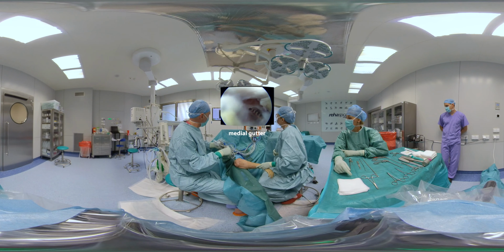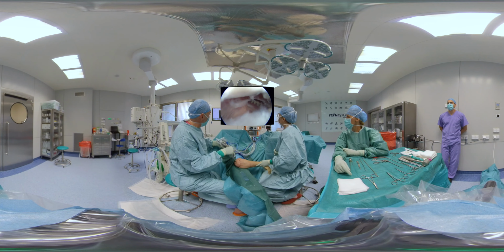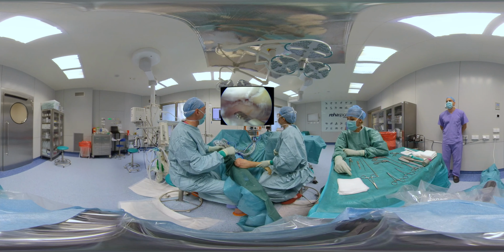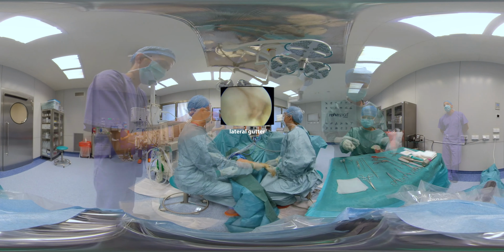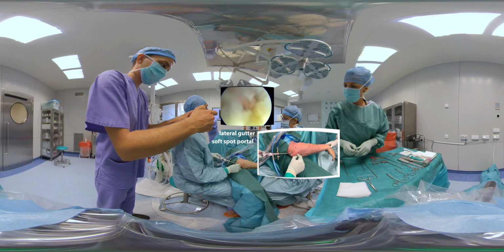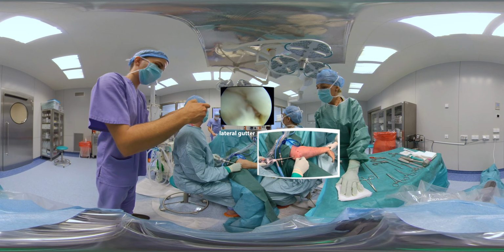Both medial and lateral gutters need to be explored in search for loose bodies or inflamed tissues. For lateral gutter, scope is moved to more distal posterolateral portal and soft spot portal is created following the needle identification.